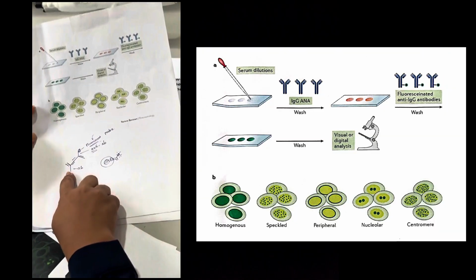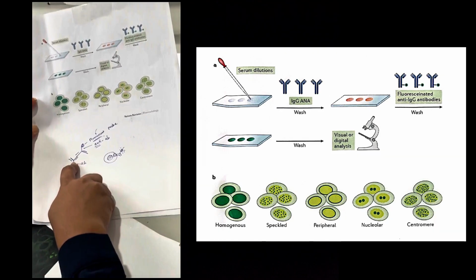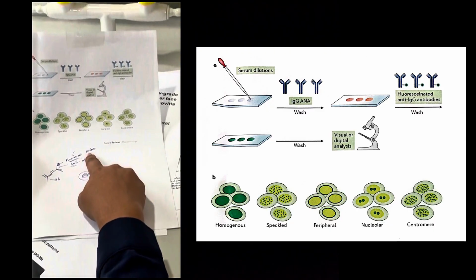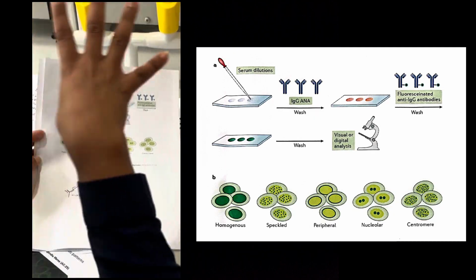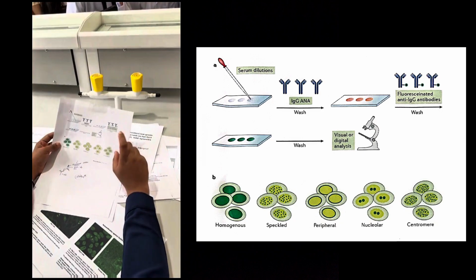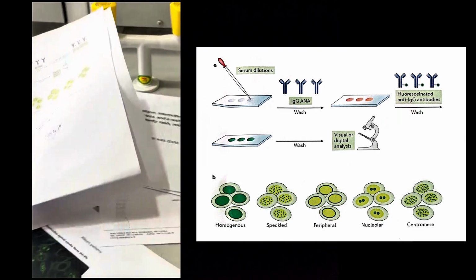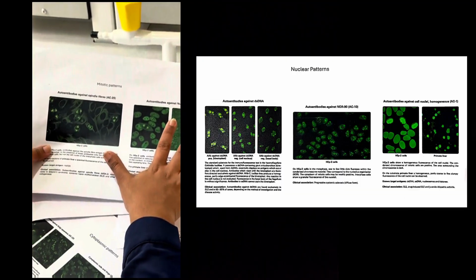This Y-shaped probe is the antibody. This probe will come and bind to that antibody. The tail of that antibody, we have marked using a fluorescent dye. Do you know what fluorescent material does? Usually fluorescent material can absorb a certain wavelength of light and reflect it. So they put this under a UV microscope, which has a UV light, not normal light. They absorb a certain wavelength of that light and reflect back a beautiful green color like this, right?